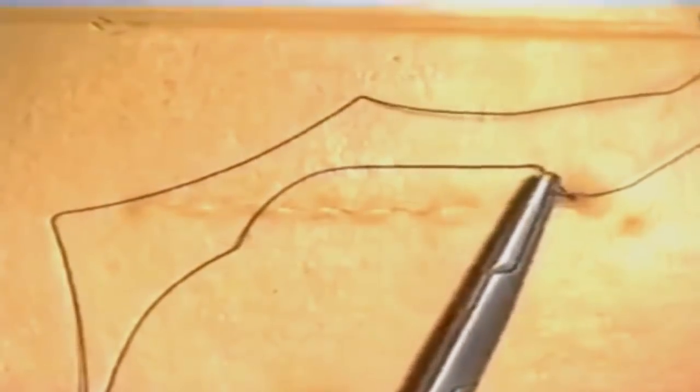At the end of the incision the needle can be exited about a centimetre away from the edge, then the needle reversed and passed back almost through the same hole in the skin in the opposite direction. This can be repeated, passing the needle through the same skin hole, back again, and then cut.